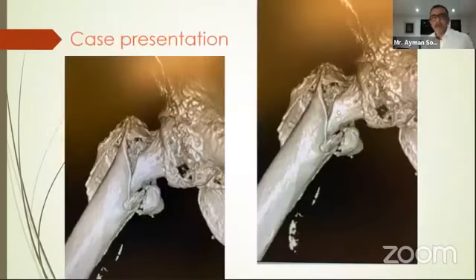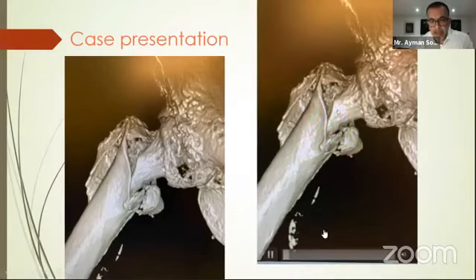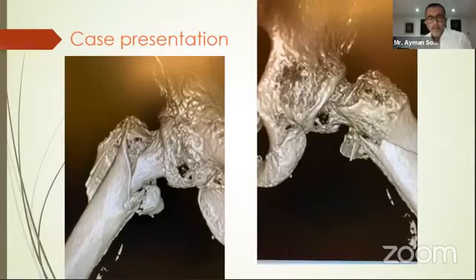Now this is another case. Would anyone classify this fracture for me? This is a CT reconstruction of this fracture. I'm going to play this video. Would anyone like to classify this for me according to the AO classification?